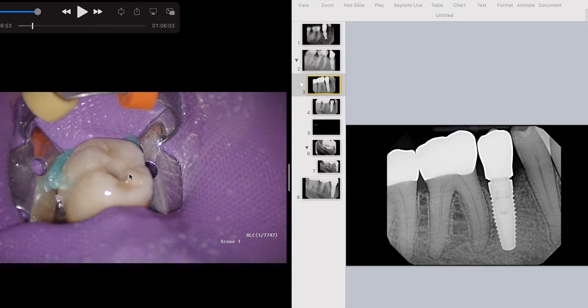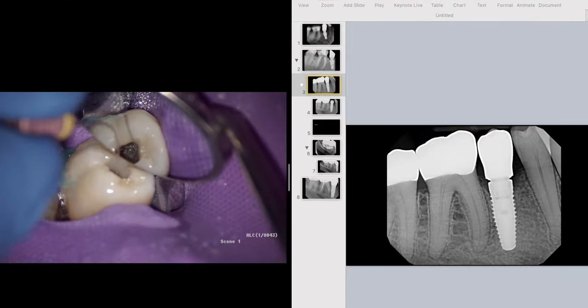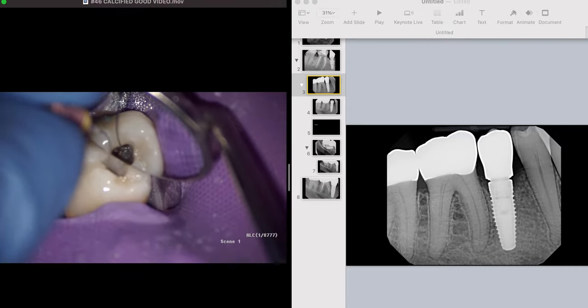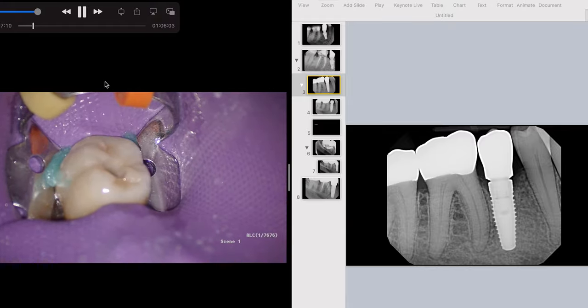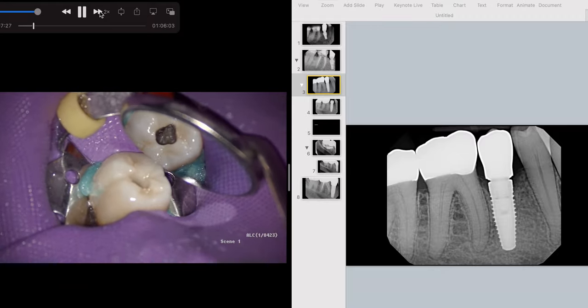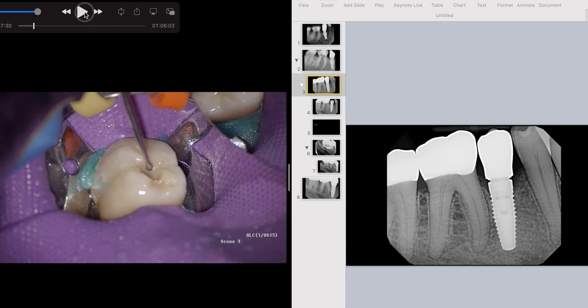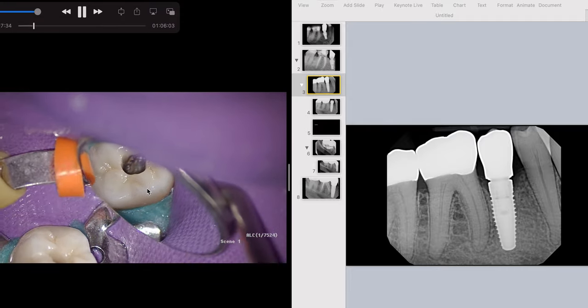One tip I've learned: the first canal you're going to hit is the mesial lingual. The reason is the angulation of the mandibular tooth — even if I angle the bur, it's always going to be the mesial lingual first. I tried a size 6 file but I'm nowhere near where I need to go yet. So I'm going to use a slow round bur — a number one, one-millimeter diameter — on a Munce handpiece. It's got a long thin shank at 31 millimeters so I can see what I'm doing. I don't use water; I have my dental assistant Dana blow air.